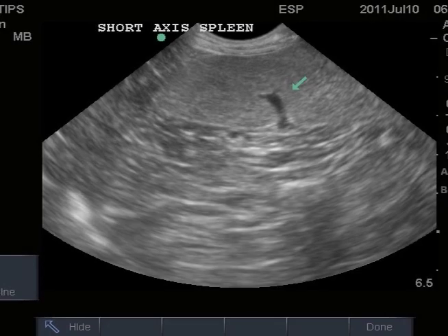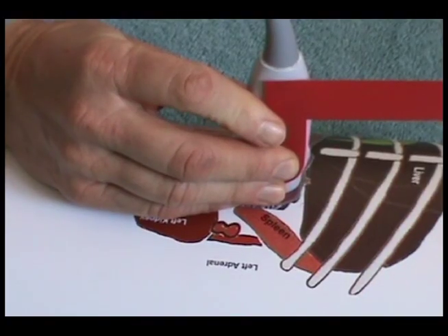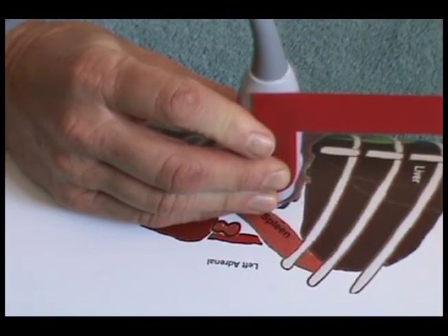The spleen is a finely textured, homogeneous tissue originating from the left cranial abdomen. We proceed next to the spleen. The head of the spleen is attached to the left lateral wall of the stomach, cranial to the last rib.